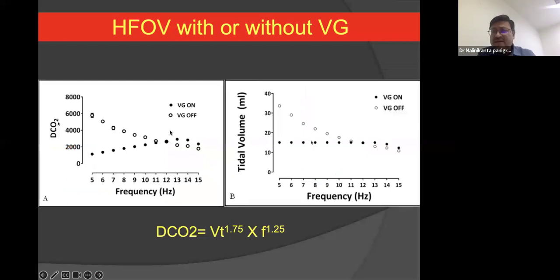Coming to the end of these three parameters, I will give the last important clues or tips. The current generation of ventilators with HFO have a volume guarantee. In the previous session, we discussed volume guarantee in conventional ventilation. We liked volume guarantee or volume target in conventional ventilation because it protects against air leak, decreases lung injury, decreases chronic lung disease, and decreases CNS injury, PVL, IVH. So we liked VG. So why not in HFO?